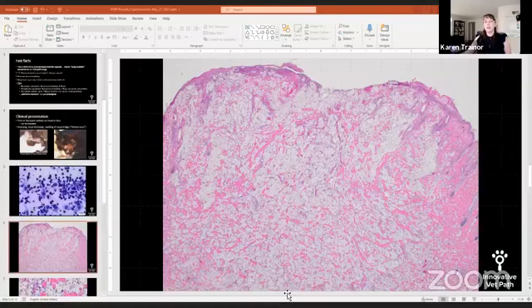And then as we're looking around, you can see within all of these clear spaces, there are organisms. And here's an example of narrow base budding right here. We can see these organisms sometimes have an almost collapsed shell-like appearance. It looks like a round structure that's partially collapsed. And here's more narrow base budding, more examples of that.